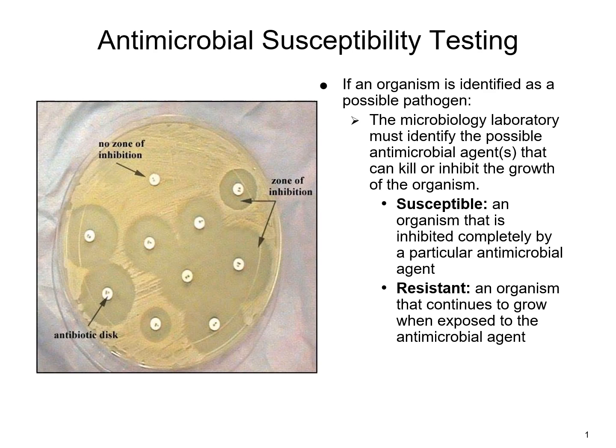One of the additional tests that is done is antimicrobial susceptibility testing. This is when we try to figure out which antibiotics are actually going to inhibit the growth of that particular organism. So you've done the urine culture, you've worked it up, you've figured out that the patient has an infection of a particular bacteria.